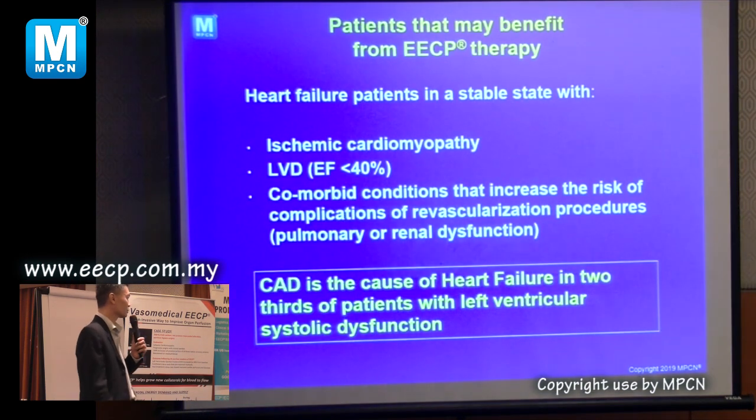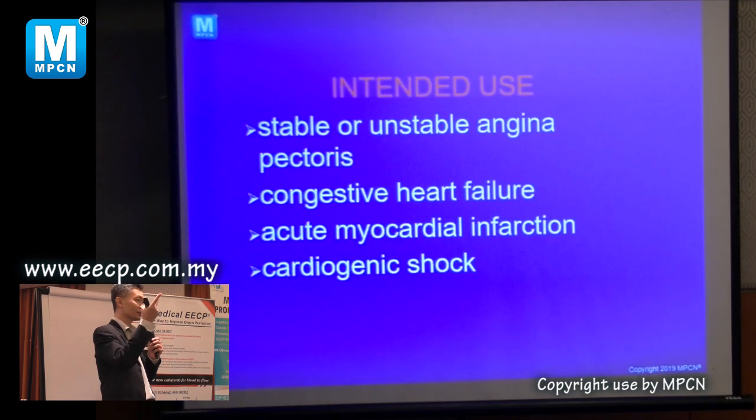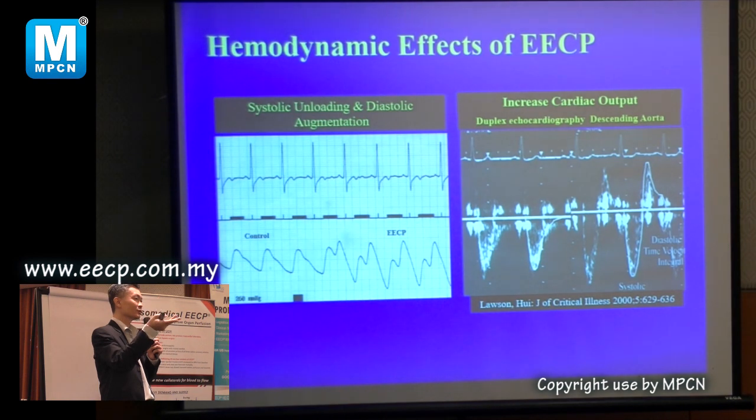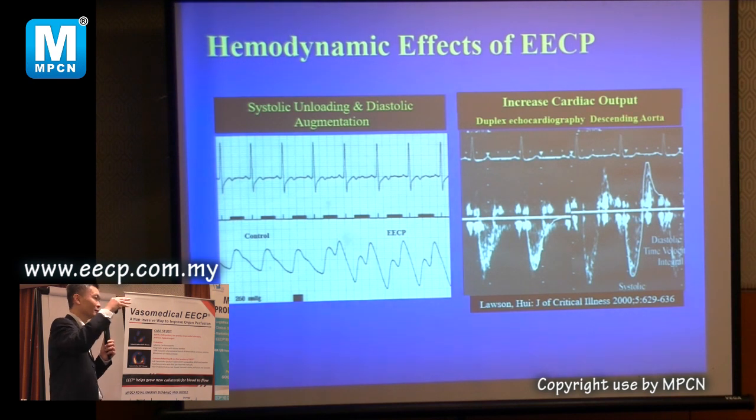But if you have a prosthetic valve, there are two types. One is a mechanical one, one is a non-mechanical one. If you have a mechanical one, you have to take warfarin. So how can you be sure that the guy's warfarin is not too high? To be safe, I advise not to do it, because of the warfarin, and also you don't know whether the valve has changed and become leaking. So try not to do that. It can be done, but you have to watch out for all these things. The warfarin should not be too high, the heart rate is regular, and you listen, there's no big murmur, then you can do it.